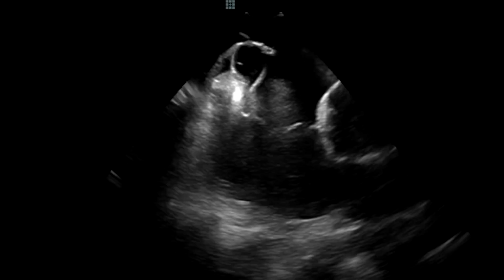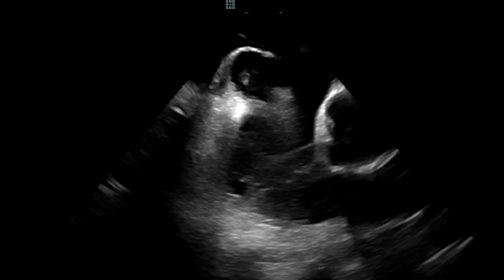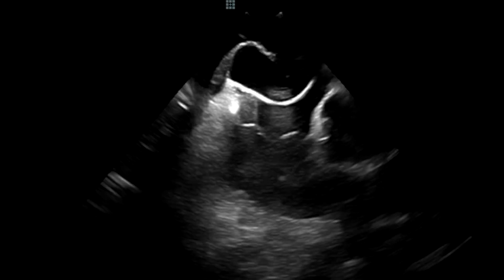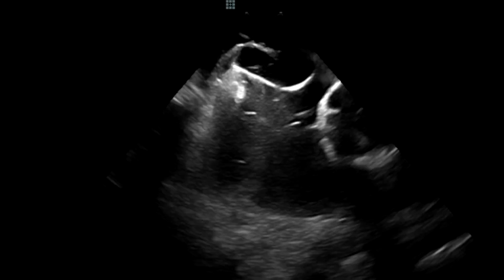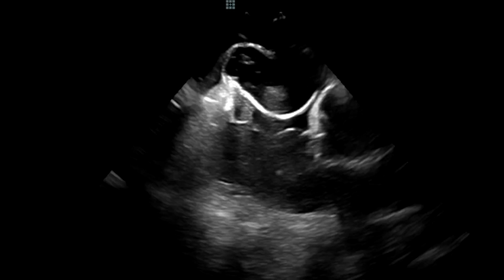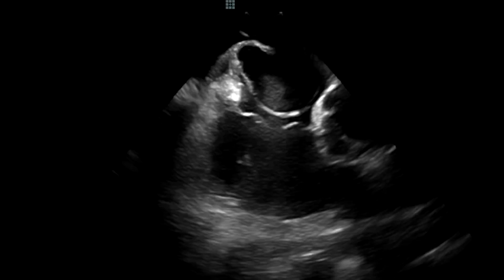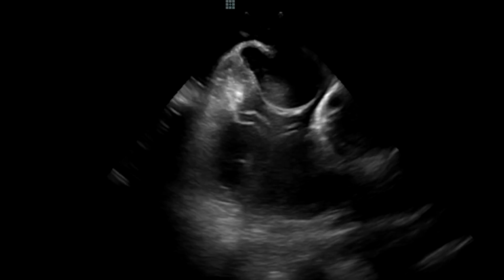Here, as you notice, we are performing catheter ablation and pulling back the ablation catheter, but since we know that that area would go under the pouch, we start performing a U-curve right there, and then slowly make the U-curve more and pull the catheter back to be able to perform the entire CTI, which includes the eustachian valve as well.